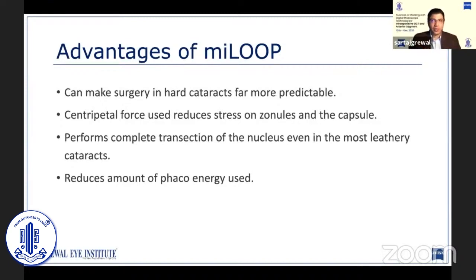Even some of the published case series have shown that the MyLoop could easily divide the nucleus in each and every case without compromising the capsule. The major reason for this is that the force is applied centripetally on the nucleus alone, not the capsule. Unlike chopping, where you are applying a stretching centrifugal force on the nucleus which is further transferred onto the capsule. With dense cataracts, the most challenging part — that leathery posterior plate — the MyLoop transects that completely. And obviously it reduces the amount of phaco energy used.